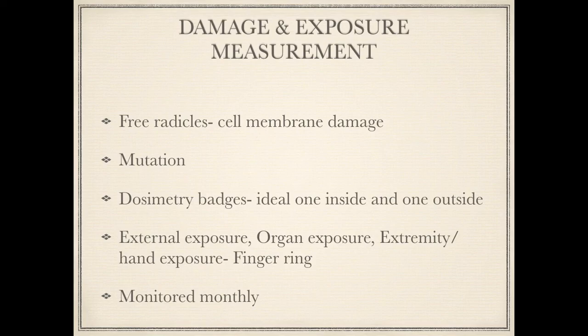That's all I've got to say for the presentation today. I hope it's given you some useful tips in terms of modifying your practice and doing simple things which can reduce not only the radiation exposure for your patients, but also for yourself and your other colleagues.